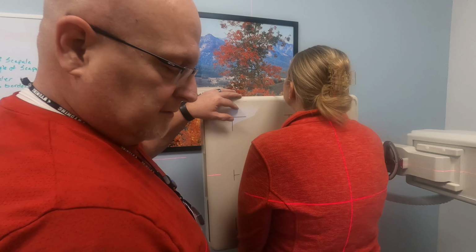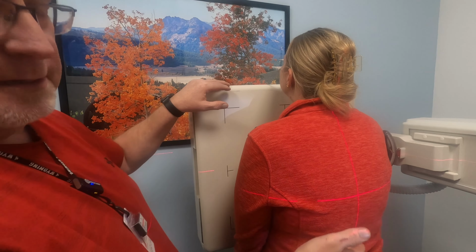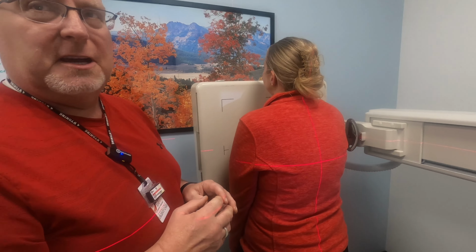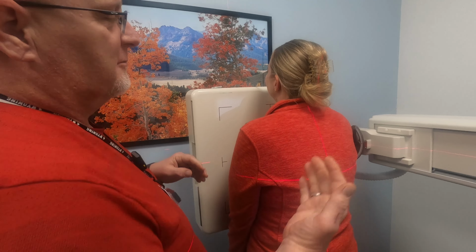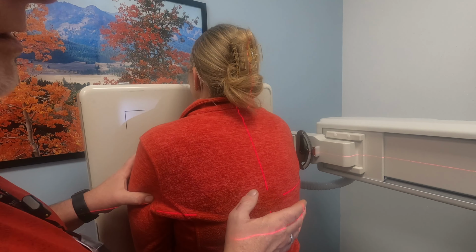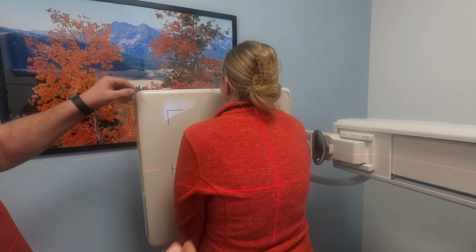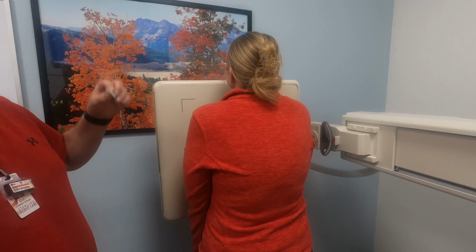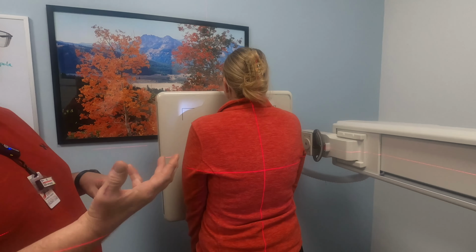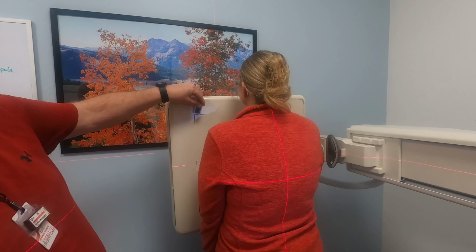And if we're open to 17 inches, we're going to get the bottom of the lung, unless the guy's a 6'10" guy, and then you may have to take another picture. But we're going to be good. All right, we got the shoulders rolled forward. Okay, we're going to have Kate take in a big breath and blow it all the way out, and take in another deep breath and hold it, and at that point you will expose.